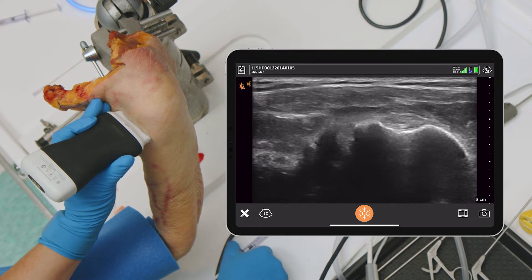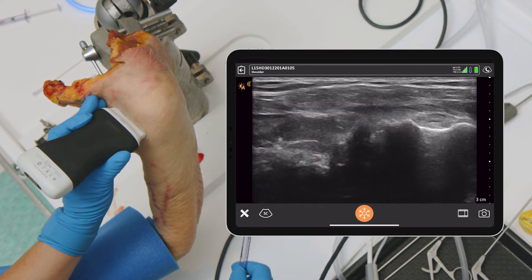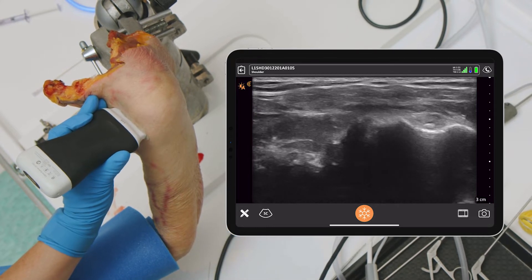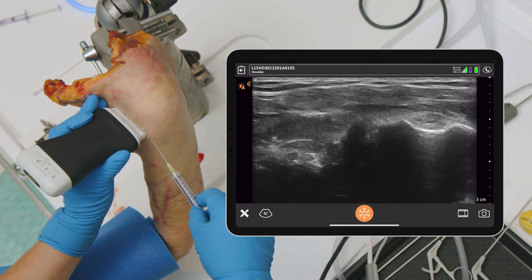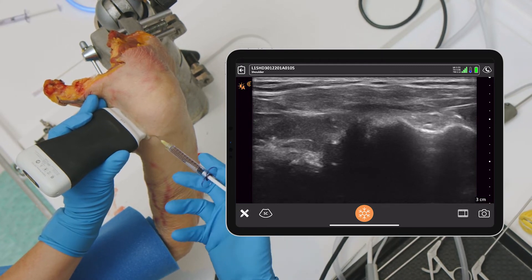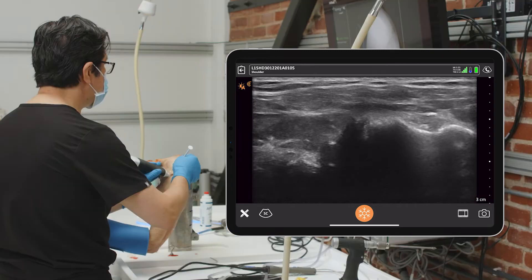So the issue to start off is just to do a very basic injection. One of the basic injections you can do is do this in short axis and then bringing in your needle just from the side to be able to come in. You can see there's a needle there — pretty easy to see — and the best way to do this is just hit the other side of the tendon.